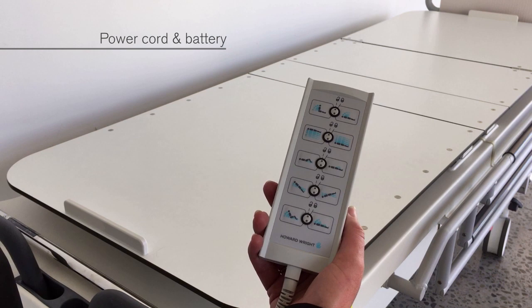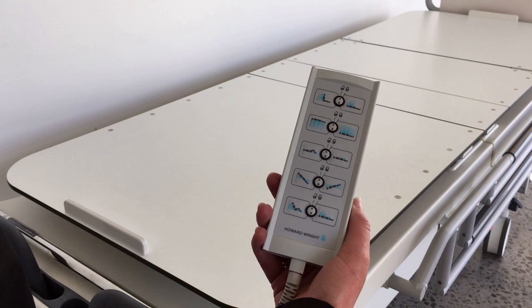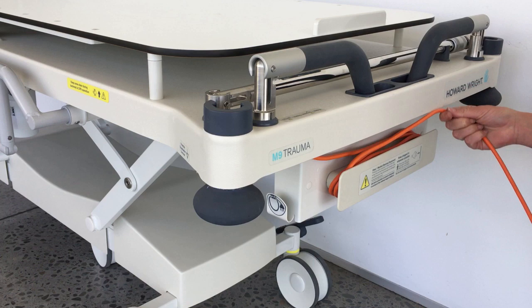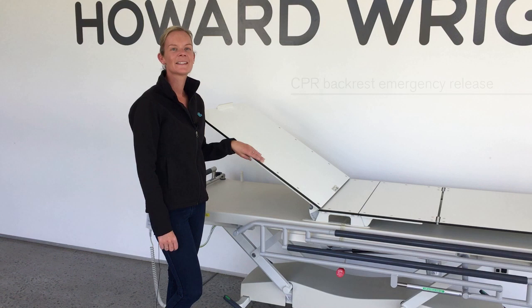The stretcher has a power cord at the head end and should be plugged in whenever possible for optimum performance and to charge the battery. When the battery runs low, a beep will be heard when a function button is pressed, and the stretcher should be plugged in to charge. When the stretcher isn't plugged in, the power cord should be coiled around the cord holder or hung on the cord storage hook.